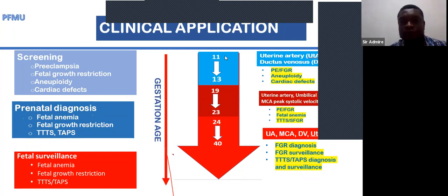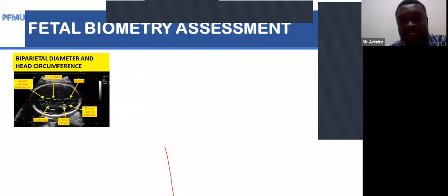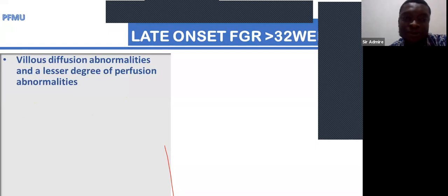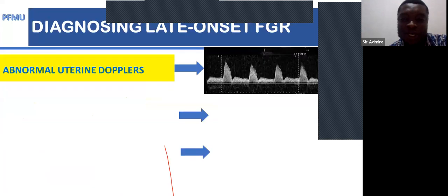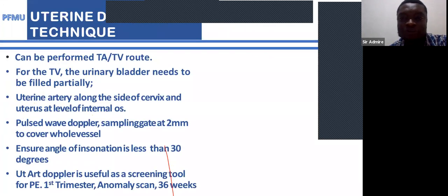Okay, I think for the ductus venosus, it's a matter of practice, because you can attack it in both planes. If you see that it has not worked in the transverse, then you try to attack it in the longitudinal. If you have been practicing long enough, I think it's a matter of practice. When I started, I used to have difficulties, but the more I continued to practice, I discovered that it's quite doable. And the waveform, I think that tooth appearance is quite typical to the ductus venosus. So I think it's a matter of practice.